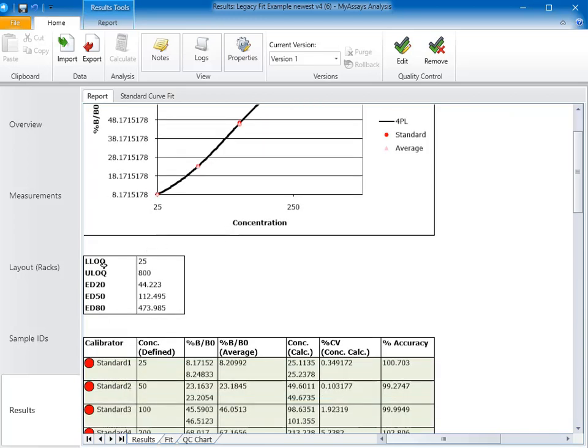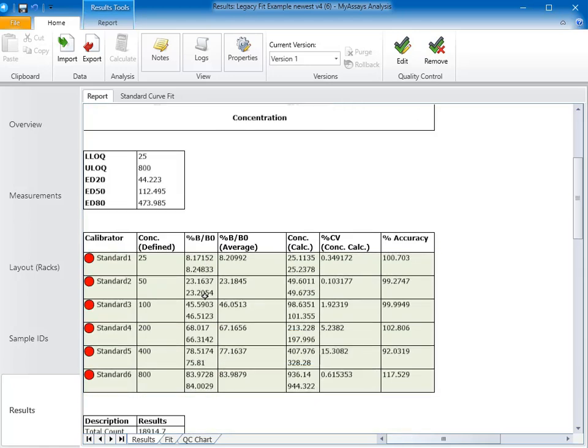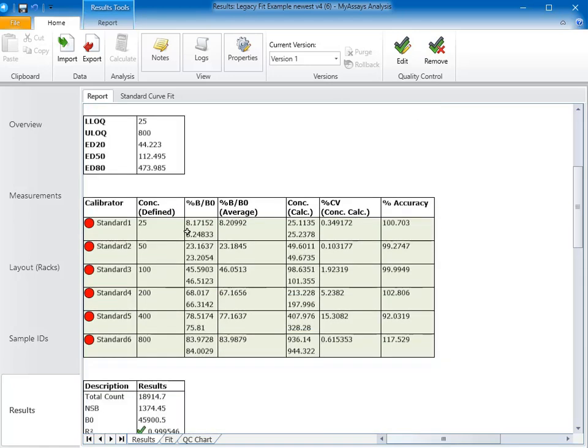In this table, you can see the limits of quantification as well as the ED20, 50, and 80 values. Below this table, you can see the curve data table. The curve data table shows our calibrator information, and you can see that all of our standards are highlighted in green, meaning the precision and accuracy are all within the acceptable limits.